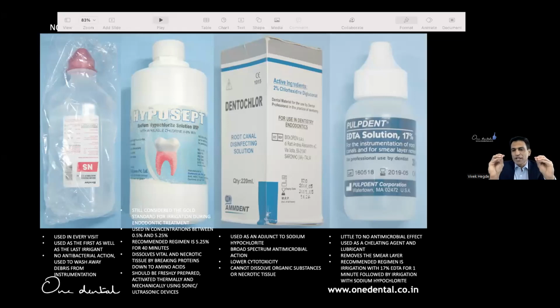And the last, forget the company name, these are just representations. The last is called liquid EDTA. That's the one irrigant which is a must to be used, where you actually put that into the system just before you close the system for obturation. Activate it, remove the smear layer, remove the biofilm, do a disruption, disinfect the whole system by that.